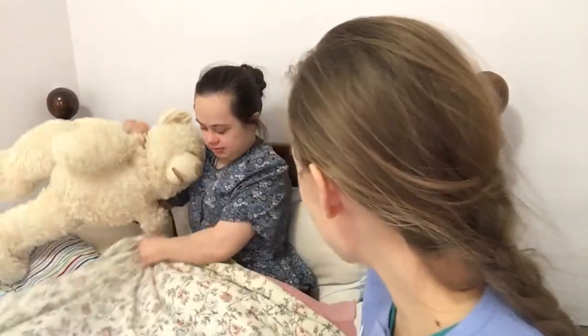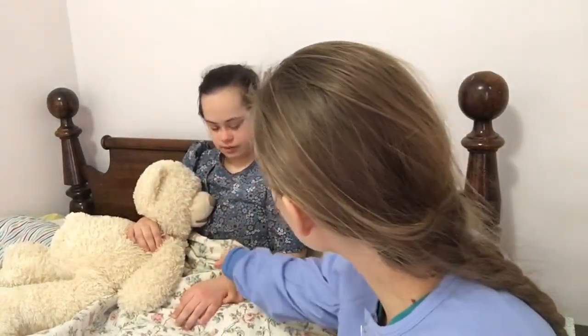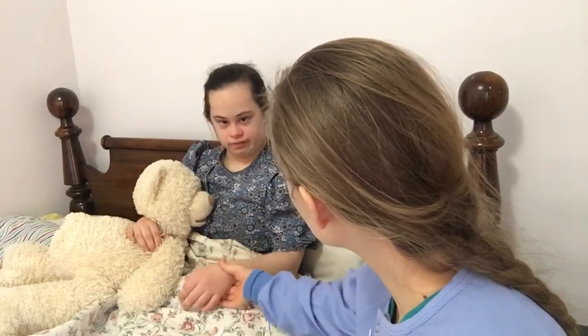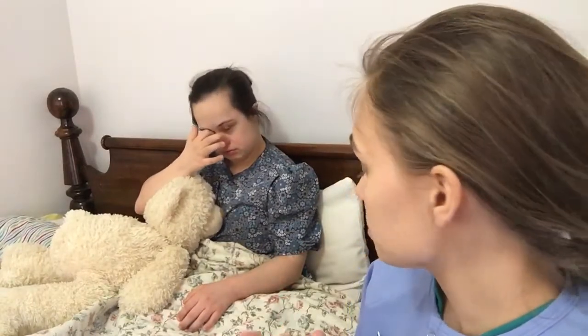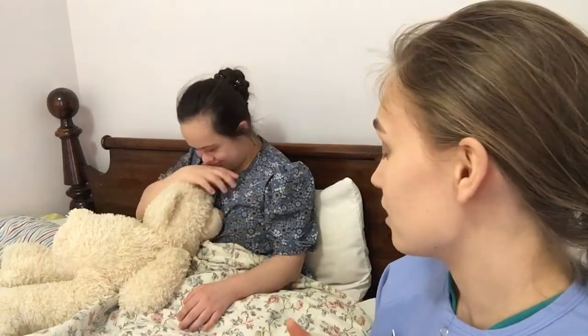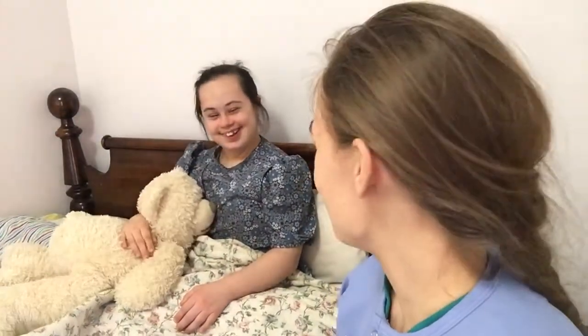Hi, my name is Faith Boysen and I'm a nursing student from HACC. I'm washing my hands. Could you please tell me your name and date of birth? I'm going to pull the privacy curtain. Today I'm going to get your pulse ox level and demonstrate the use of nasal cannula, the oxygen face mask, the non-rebreather mask, and the incentive spirometer device as well. Do you have any allergies?